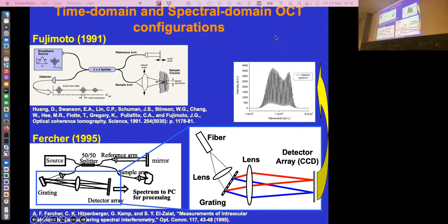And what do I see here? I see a very dense pattern of interference maxima and minima. Let's imagine that I look at one particular maximum for a very narrow wavelength. Basically, that's a monochromatic line. I get an interference maximum. What does it tell me about the path length difference between the sample and the reference for that particular wave? It's very small, but can you say more than that? Because I see constructive interference for this particular peak.